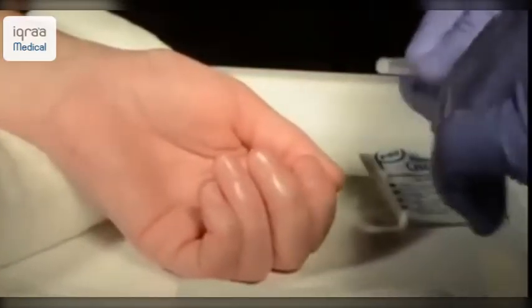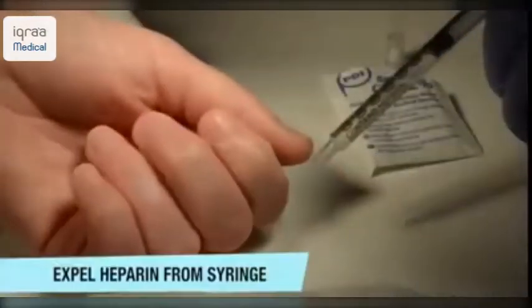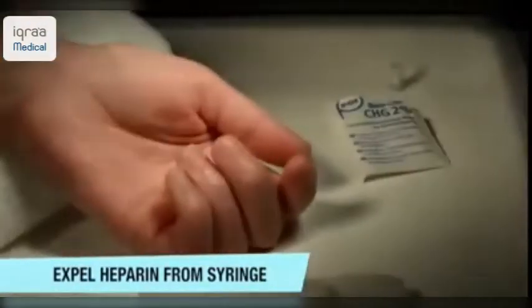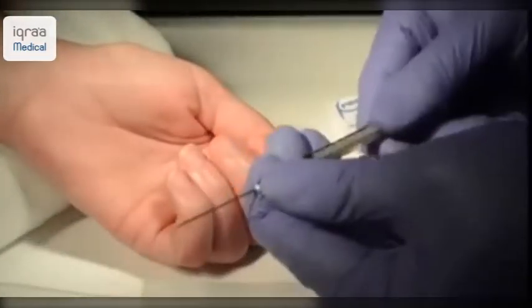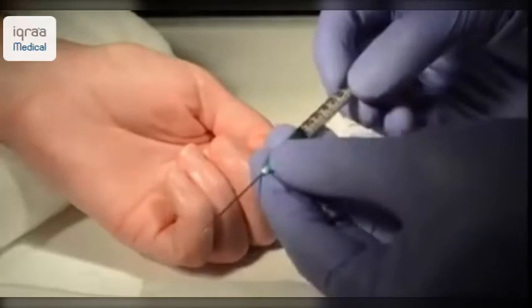To prepare the ABG syringe before use, make sure you expel the excess heparin from the syringe. Then affix the 21 gauge needle to the end of the syringe.